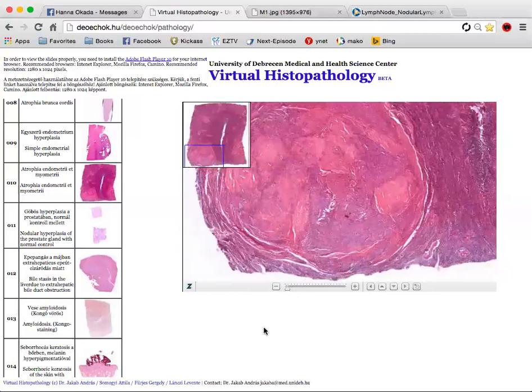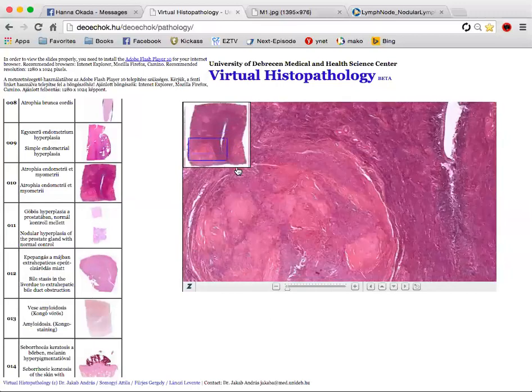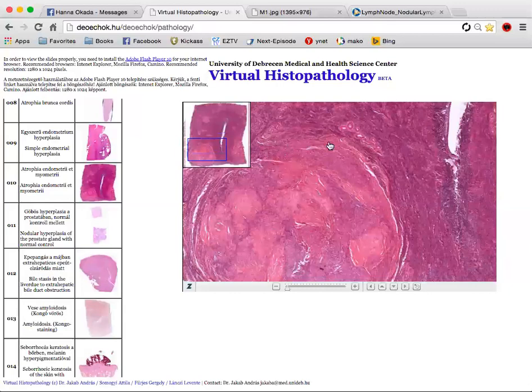Yeah, sure. The leiomyoma will push the normal tissue, so that's why atrophy will occur. So it's just a little atrophy in the surrounding tissue, not because of the lack of estrogen. Right, not in the myometrium.